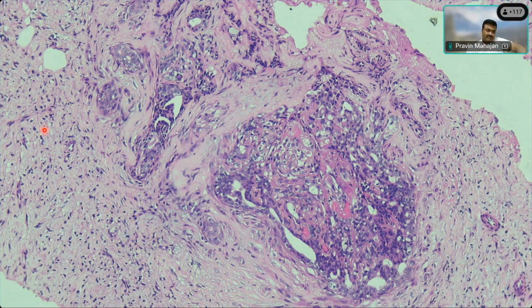But surrounding it, there is this spindle cell proliferation having this atypia. So what are your differentials, Shefali? I think Shefali was describing, right? Yes, sir. Very good, nicely described. So tell me now, what are your differentials on this case? You have to give the differential based on the site. That's very important. Although it is a spindle cell lesion, what is the site?